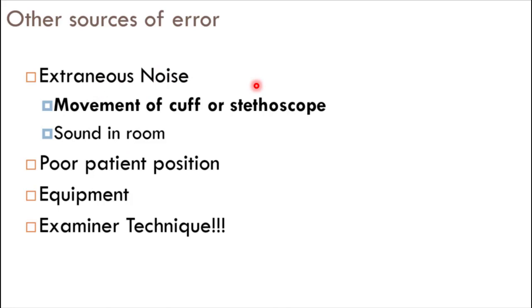As you get used to setting up the cuff and getting people going, you'll be aware of how your lines are crossing and where you're placing your hands, and it's just getting familiar with the juggling act. Like I said at the beginning, there's a lot of moving parts. Once you get used to that, and that's why we practice this quite a bit, you're pretty set. And then you will practice with the patient position and the equipment you'll just get comfortable with.